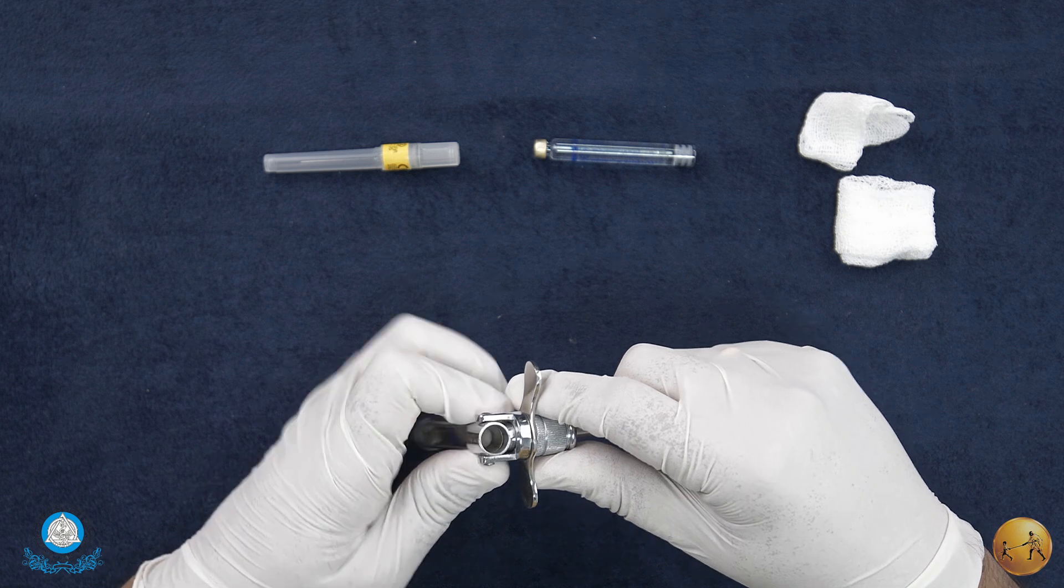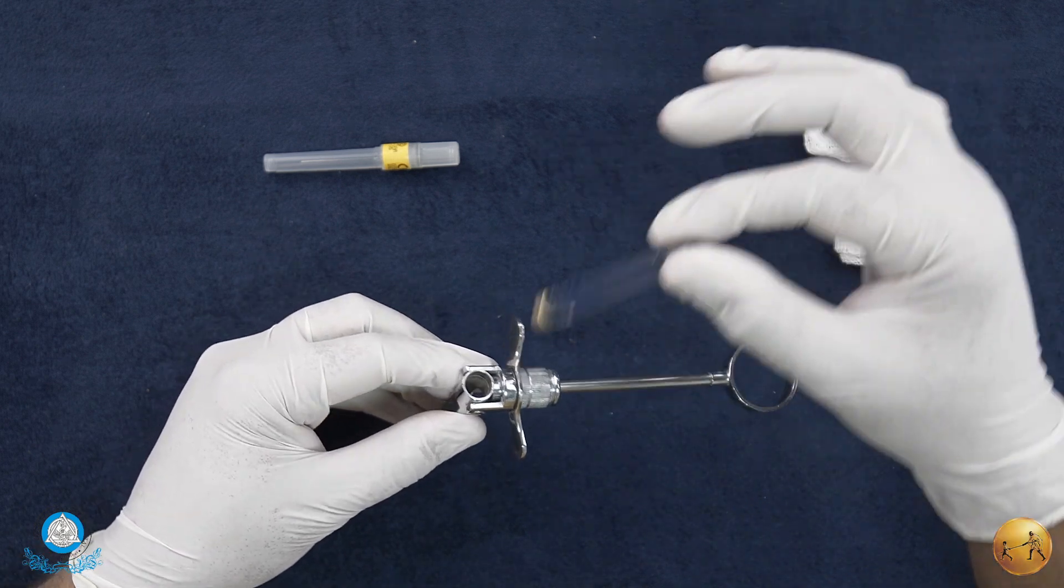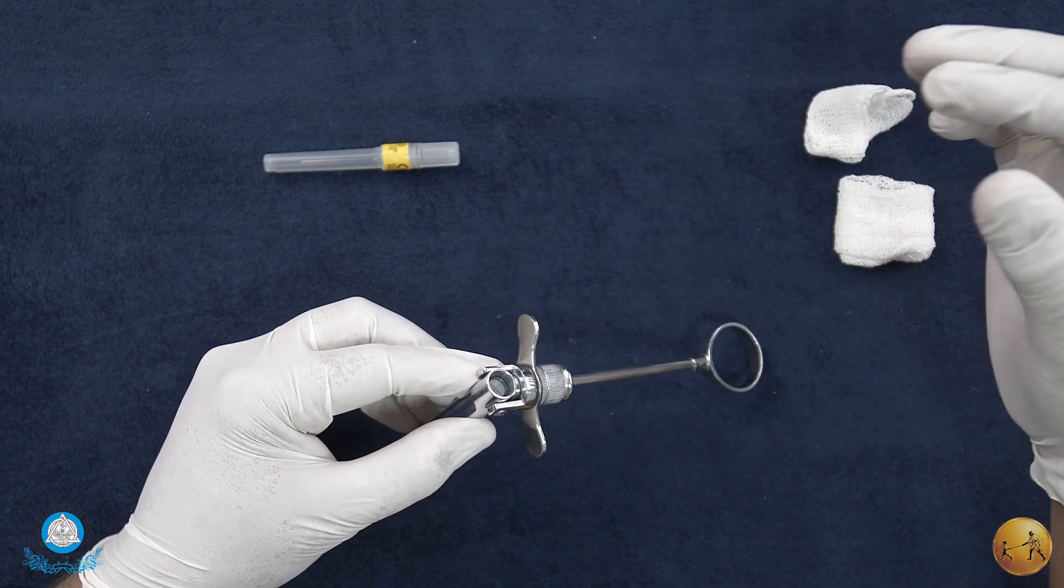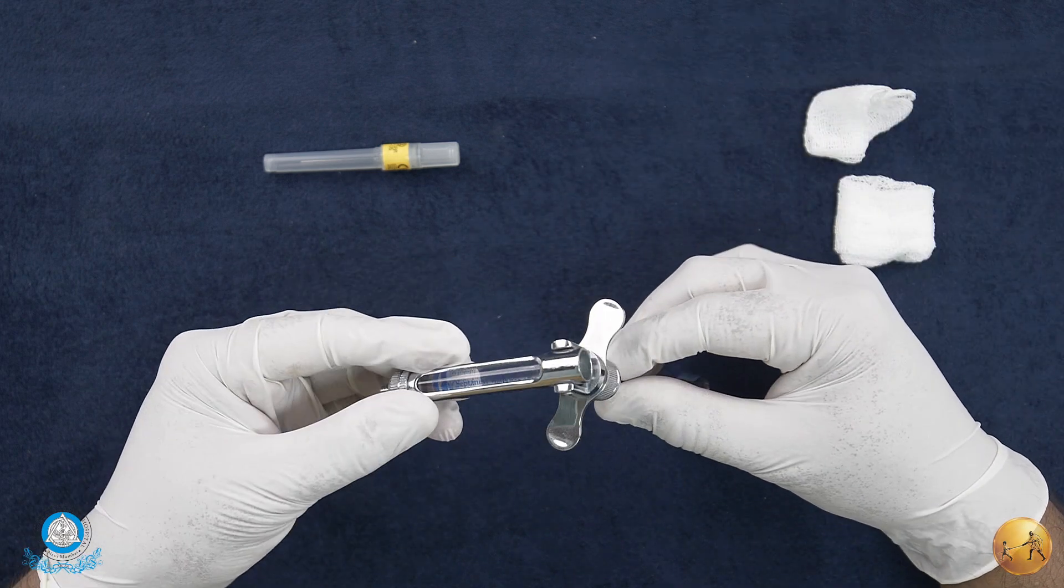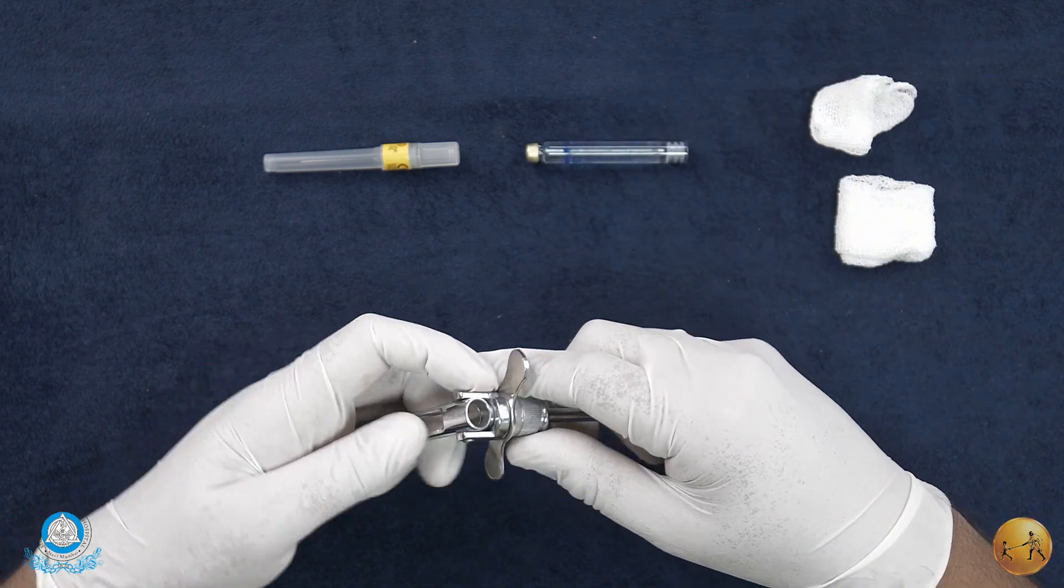To show you how it's loaded - this is an end loading system. This is where the cartridge goes in, like this. You can see the cartridge in place.